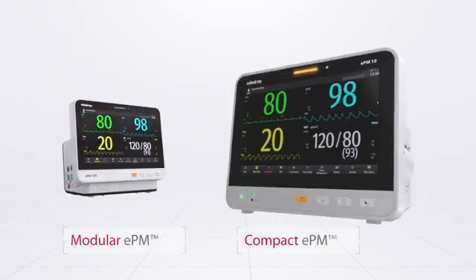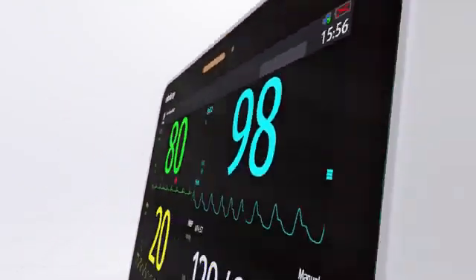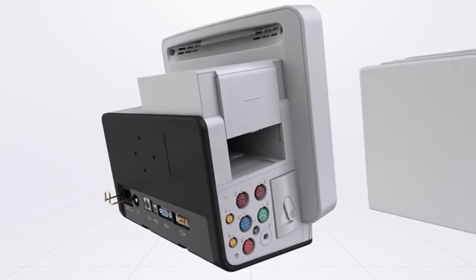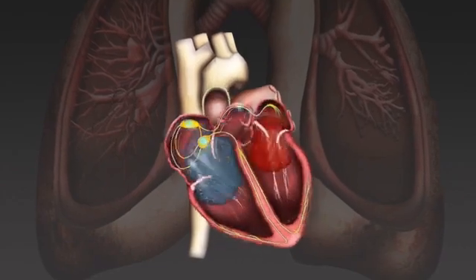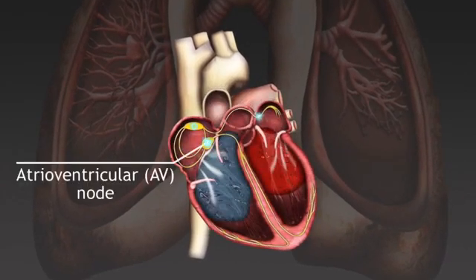We have covered classification of patient monitors and their measurement parameters in our last video. Let's discuss the parameters in simplified detail. Let's begin with ECG measurements. The recording of the electrical activity associated with the functioning of the heart is known as an electrocardiogram.